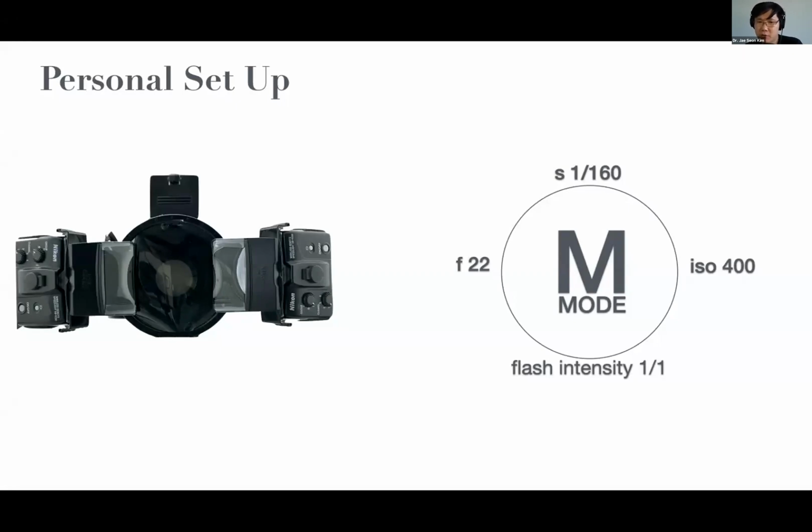If you take a photo like this, and this is my setup, but this isn't the only setup that I use. I always change this, and that's why I talked about all the different settings and the components of how to control the light. Let's say we took a picture of this and the picture was too dark. What would you do? Well, first of all, I would probably try to move closer to the object. Whenever they say, if you take a picture, it doesn't look good, just move closer to the object. That's what they say, right?